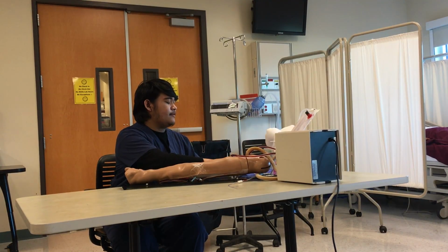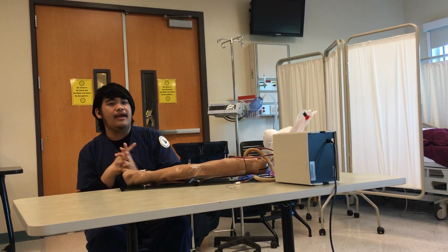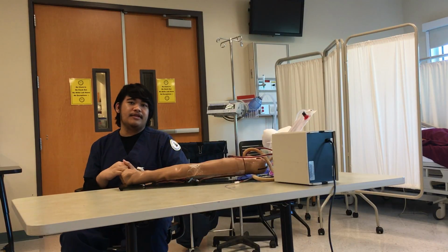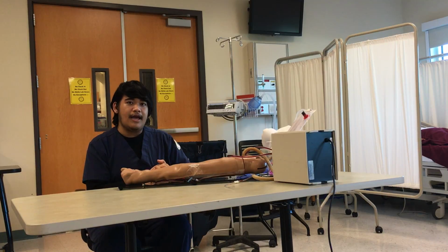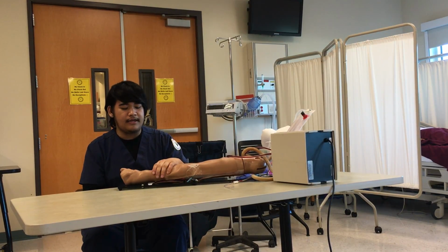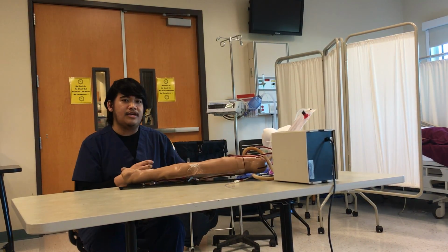After filling out the requisition slip, I'm going to wash my hands, knock on the patient's room door, enter, and introduce myself to the patient or the family member. Hello, my name is Delo. I am from the respiratory department and I'm here to do an ABG test. Then I would ask the patient to state his or her name and date of birth. I would also check the wristband and the medical number, scan it, and make sure that it's the right patient.